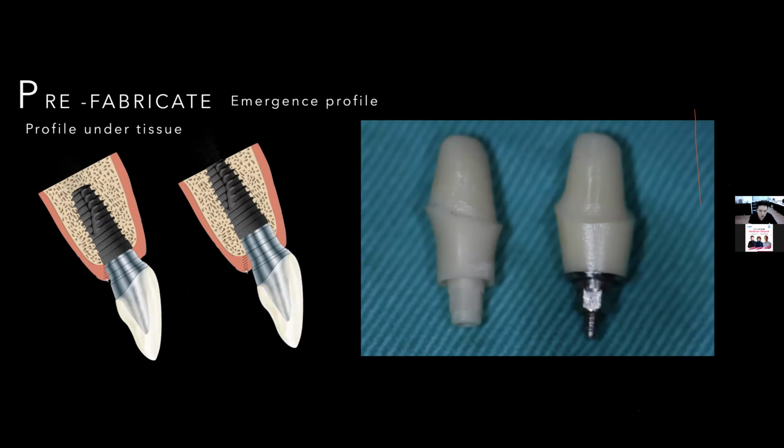Because when your tissue resorbs and your height is different, if you choose a metal custom abutment, sometimes that will be exposed and it's very, very ugly. But if you choose a zirconia abutment, maybe it's better. Zirconia is also more friendly for our tissue and the bone. But it still can't decide to convince our tissue.